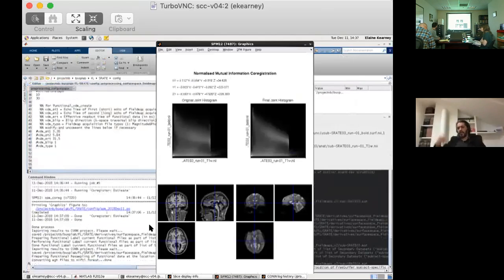Yeah, remember, Jason, that we had at some point thought of a measure to estimate to what degree the functional to structural co-registration was good or not, in terms of a single number, right? We discussed using the contrast, the measure of how uniform the values were within, or across versus within, if you took the white matter surface. That was what it was.